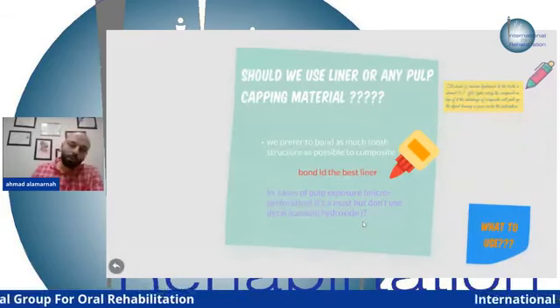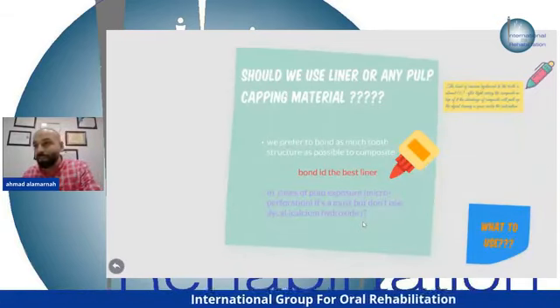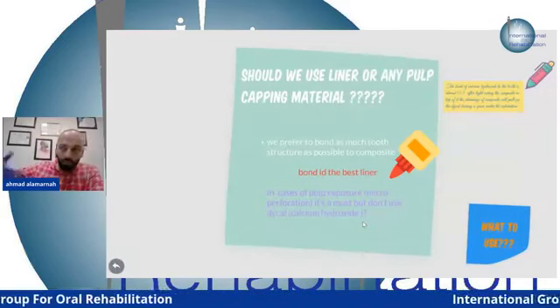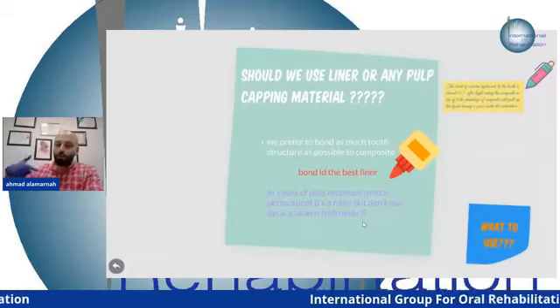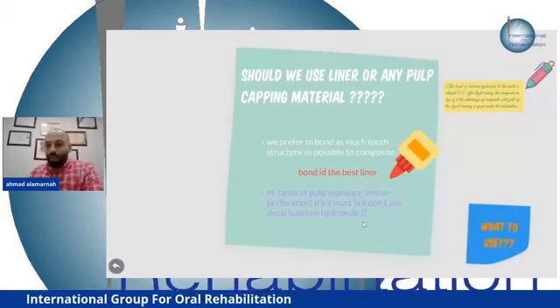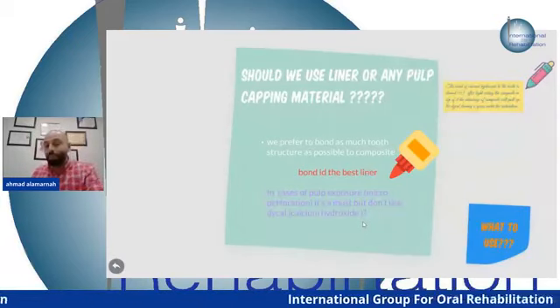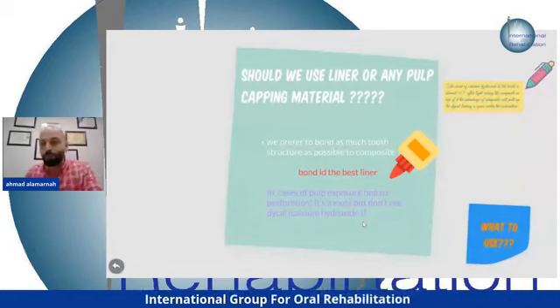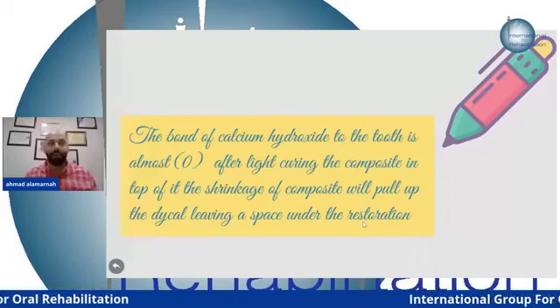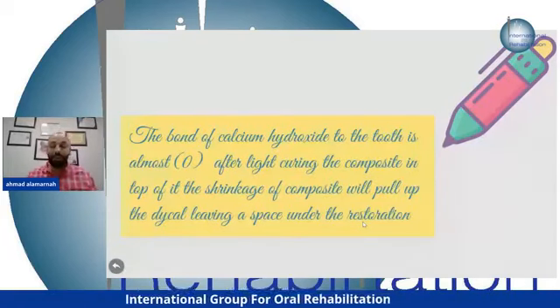If you use your bond above it, it may sometimes cause some sensitivity, because there's a communication between the fluids within the dentinal tubules and the pulp, and it's very, very close to the pulp. So there will be some irritation. All the time they say use Dycal, the calcium hydroxide. We say no, we don't use calcium hydroxide. Why? Because the bonding of the calcium hydroxide, the Dycal, to the dentin is zero.